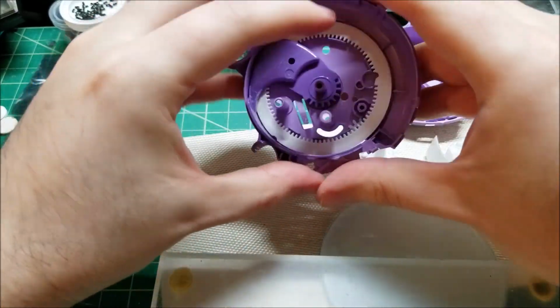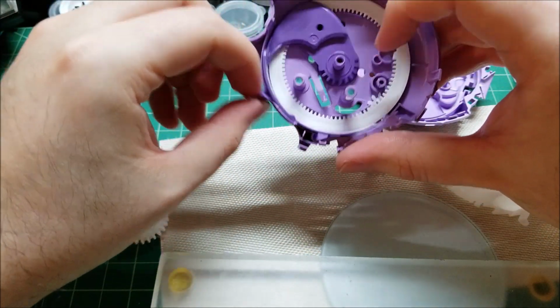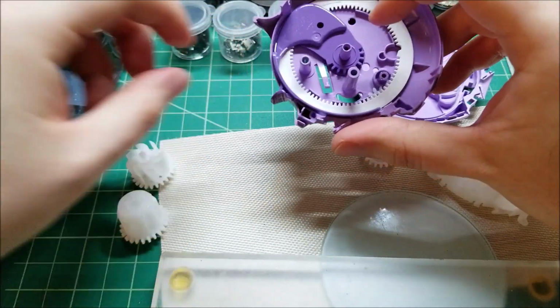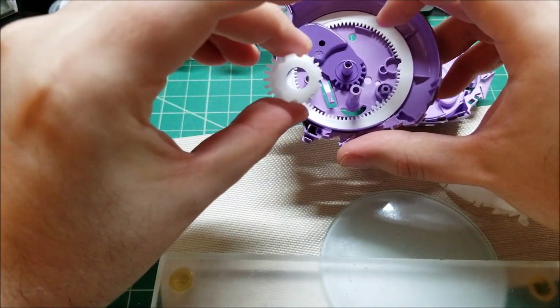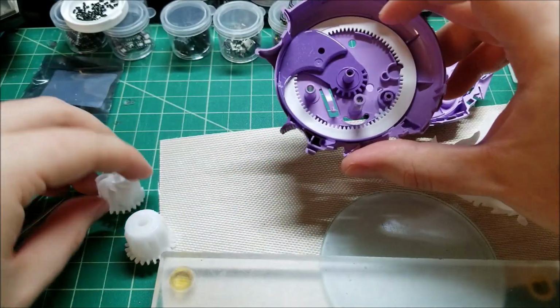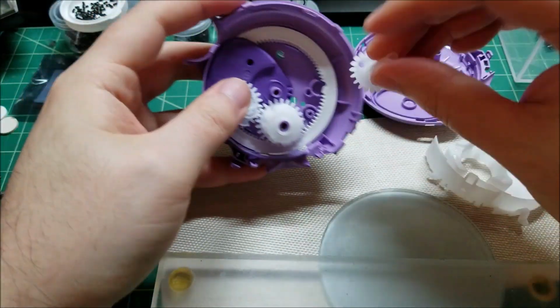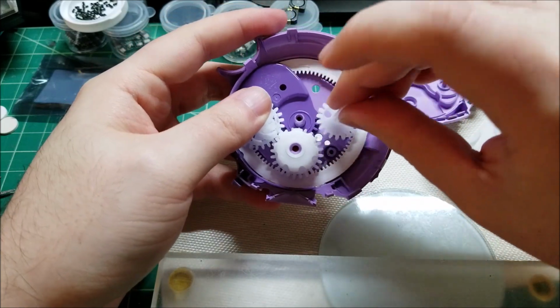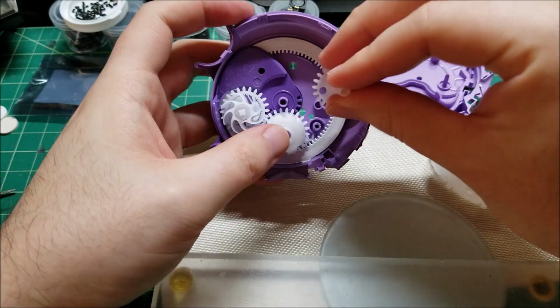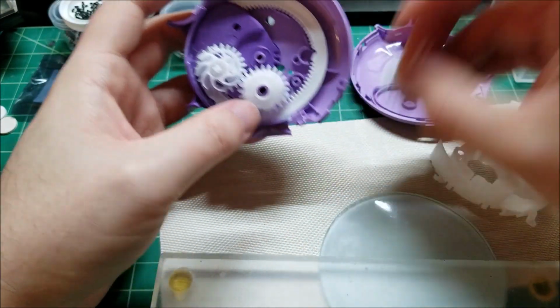And we have this inner side, which has kind of a semi half gear that will move the mechanism. It actually moves it through this gear first, and then through the bottom of this gear. So you can see, if I insert, let's see, I think this piece was held in by the mid frame, but you can see here, that's how it would mesh.